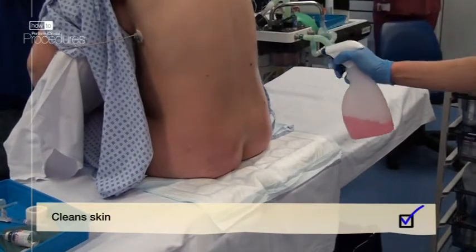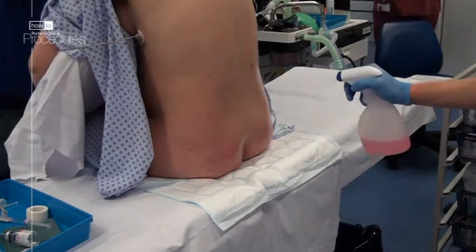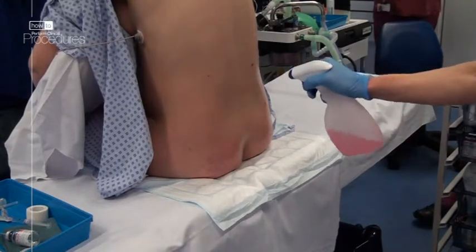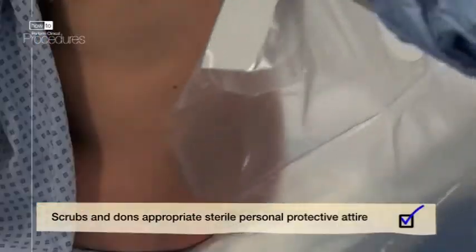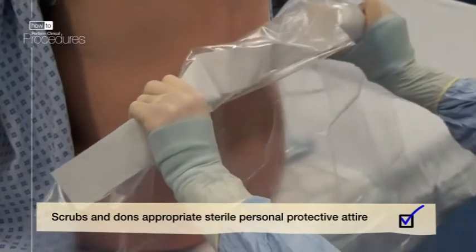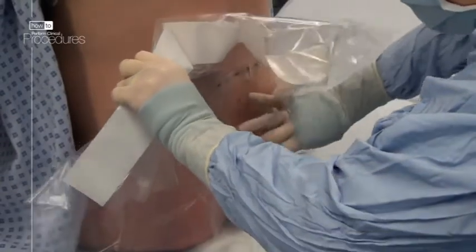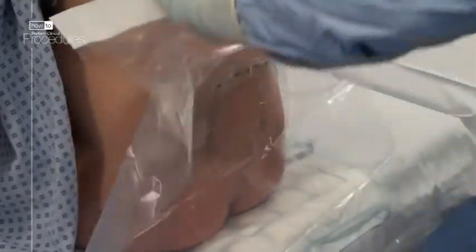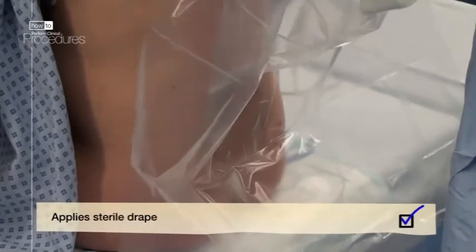Once you're ready to start, scrub up and put on sterile gloves and gown. Transparent adherent drapes with an aperture in the middle, like this one, are ideal for making a sterile surgical field. It can be secured to the shoulders.